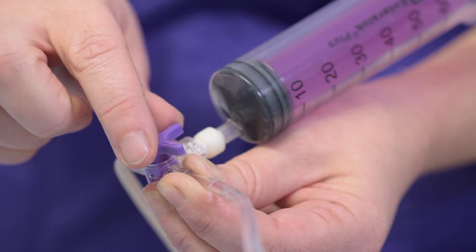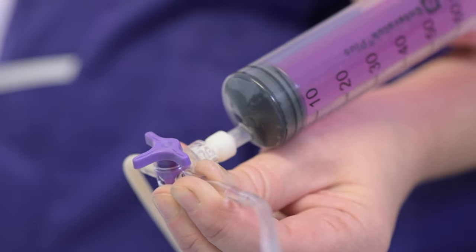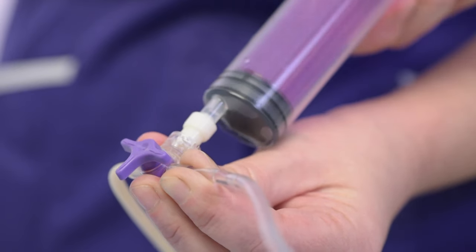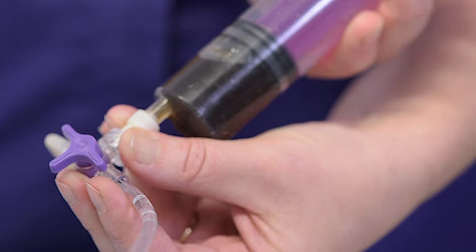Turn the valve to close it and remove the syringe. Attach the medicine syringe.